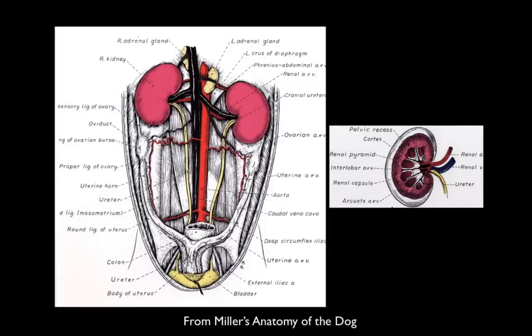On this anatomical drawing, we can see that the kidneys are located in the retroperitoneal space. Both renal vein and arteries are emerging nearly perpendicularly to the adjacent caudal vena cava and aorta, while the ureters are diving caudally nearly parallel to these vessels. The kidneys are bean-shaped in the dog, and the right kidney is slightly more cranially located than the corresponding left.